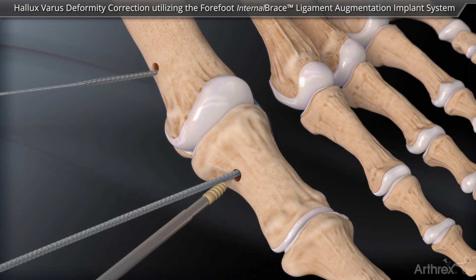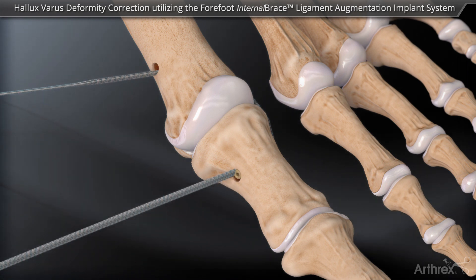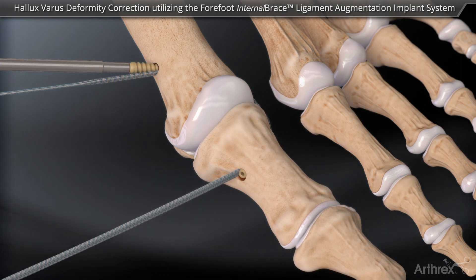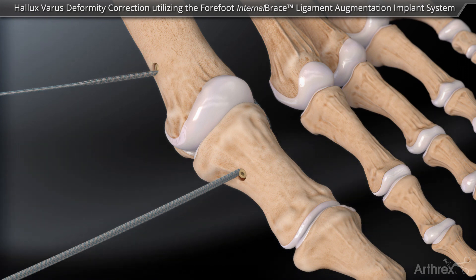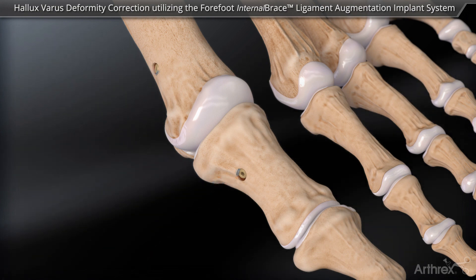The fiber tape is secured to the proximal phalanx using a 3 by 8 mm peak tenodesis screw. The toe is placed into the corrected position, the fiber tape is tensioned, and the second screw is placed into the metatarsal head drill tunnel. Upon final fixation, the excess fiber tape suture can be excised.